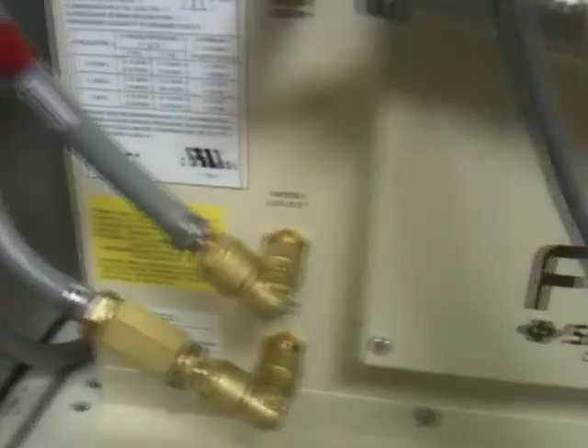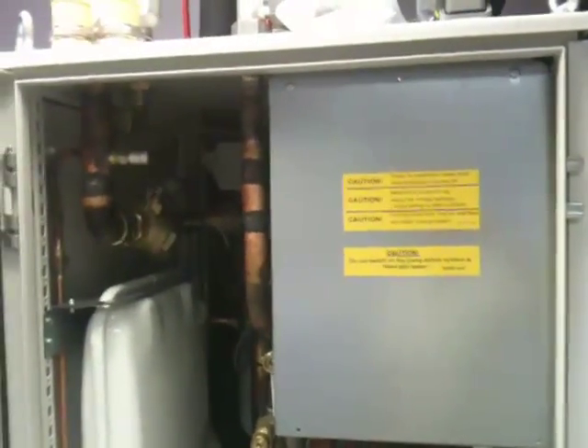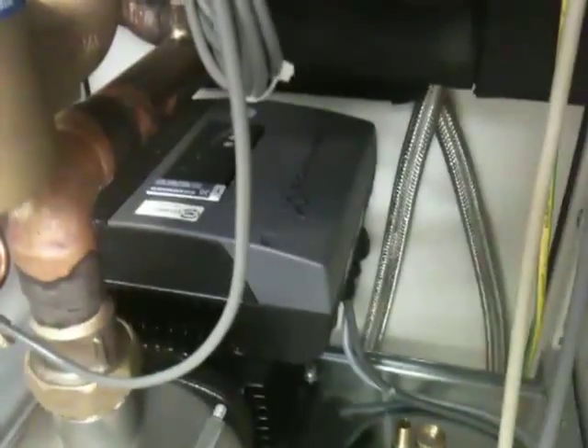Cooling water supply going up to the main cooling water distribution pipework. There's a coolant reservoir in white, a series of valves, a pump, and inside there are some isolation valves. There's a thermometer at the back.